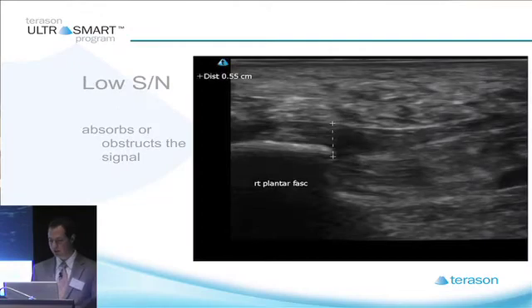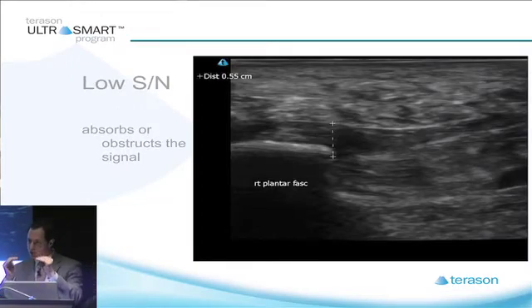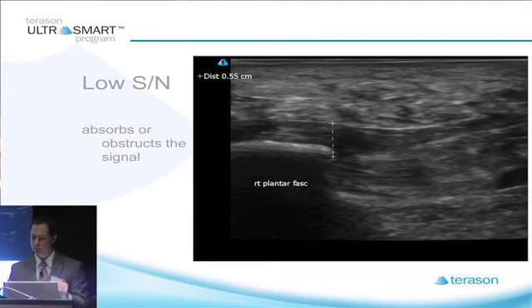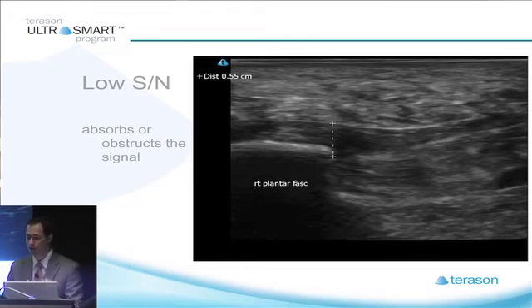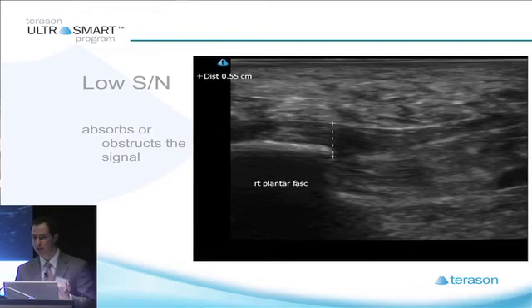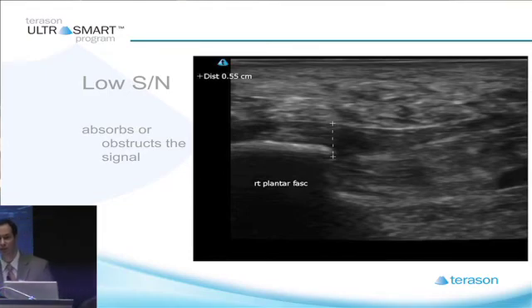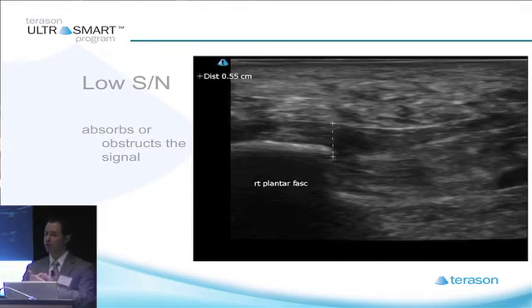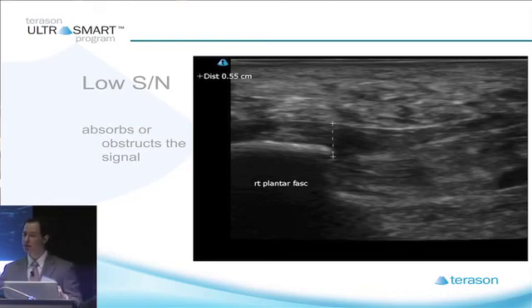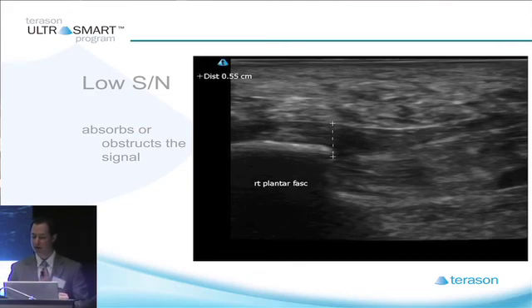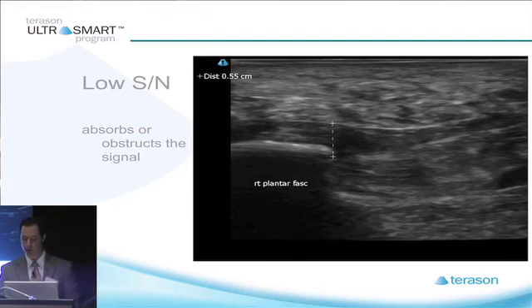Anything that diminishes your signal — anything that absorbs or obstructs the ultrasound waves — degrades image quality. A good example is the heel: right under the calcaneus is a big thick layer of dense fat. When you put ultrasound on that fat, it absorbs a lot of the sound waves. The waves try to pass through the fat and turn into heat, causing a graying effect. Everything starts to look more gray and faded — areas that would normally be very bright and white shift toward gray because the signal is obstructed.